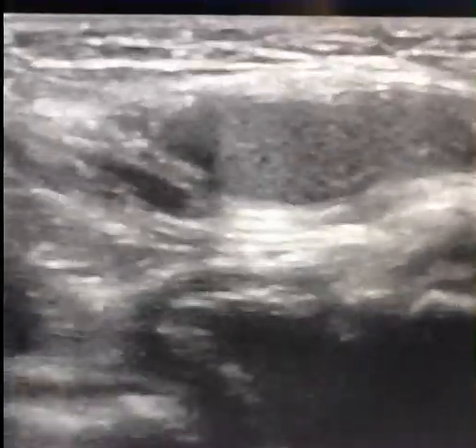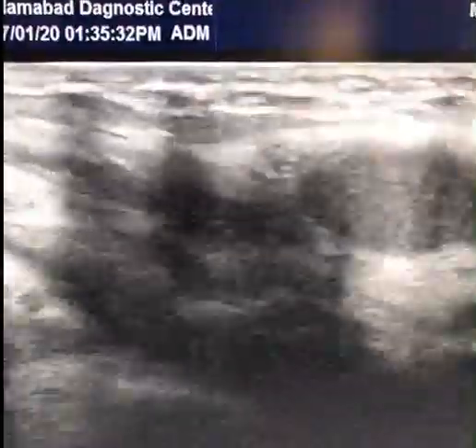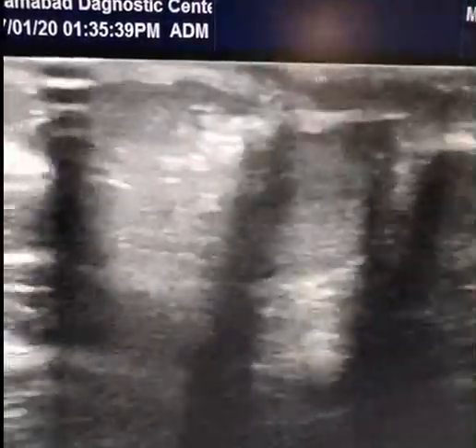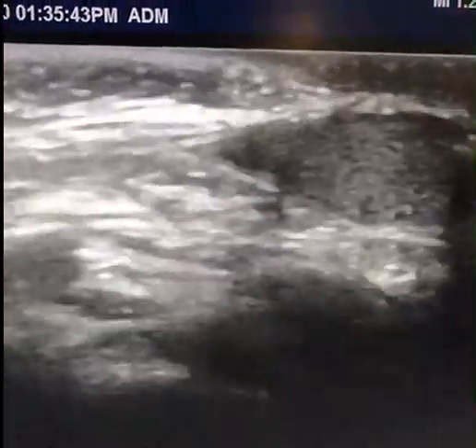Okay, now I'm going to try to push it back in the scrotum. So I'm pushing it. See, it moves with the scrotum. Now I'm going back. This is scrotum. Here it again lies close to the left side. Okay, look at it again.